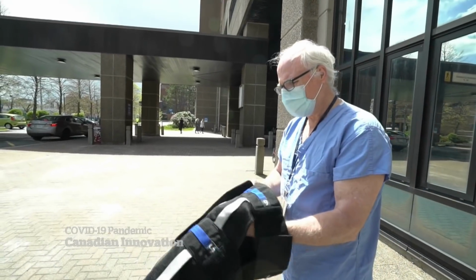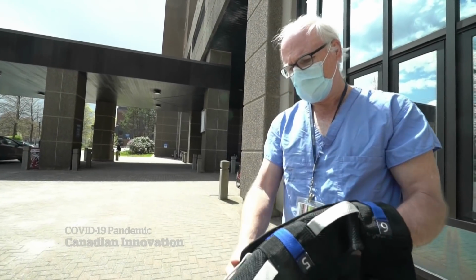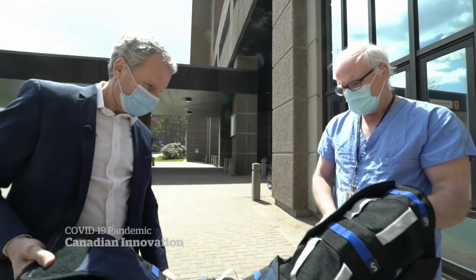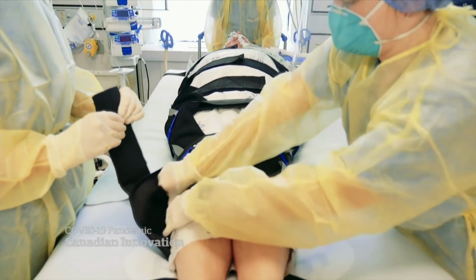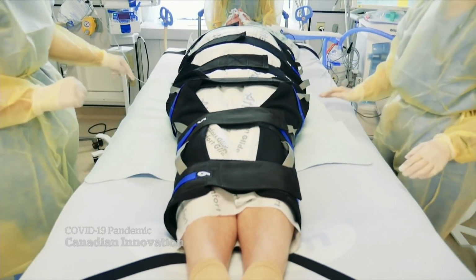Extremely strong Velcro, and basically it is a 2-piece blanket that attaches so that you end up with a method to open the back as well as the front. Think burrito with Velcro straps. Yeah, it's not sexy, but it works.